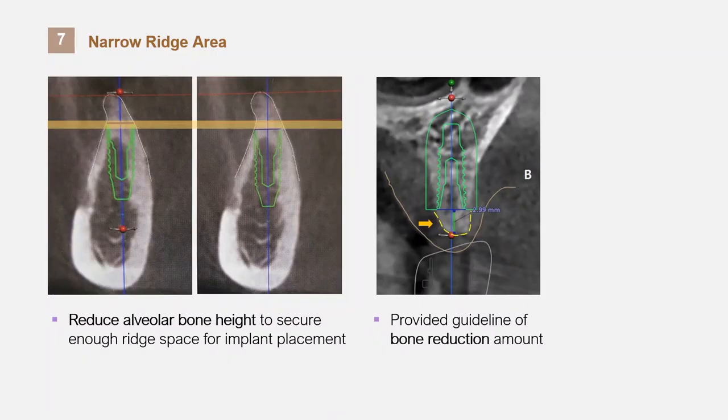Currently, if a substantial amount of bone needs to be deleted, the DIOnavi team adds comments on the amount of bone that needs to be deleted by measuring the value in millimeters. As you can see here, the DIOnavi team added 2.9 millimeters to delete.